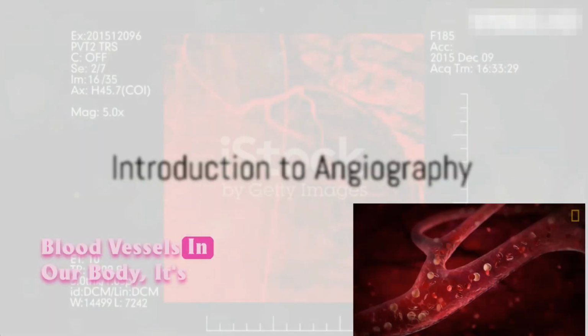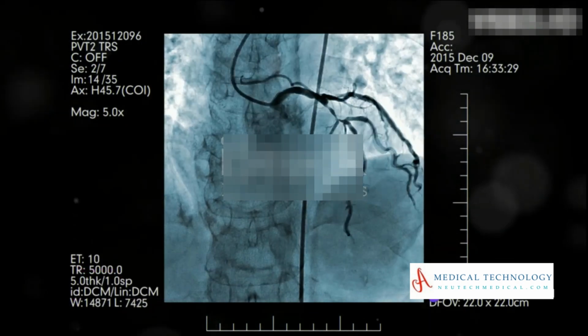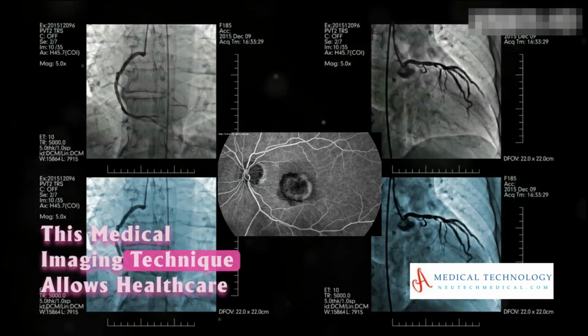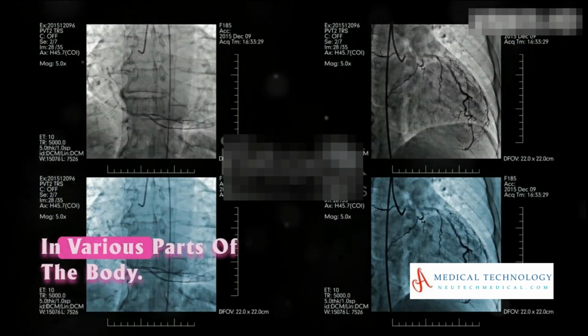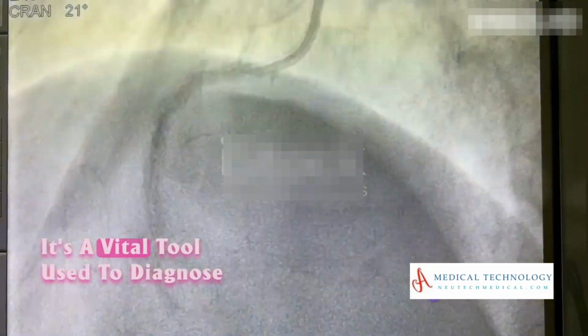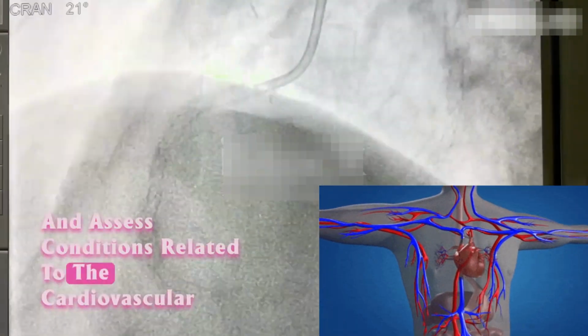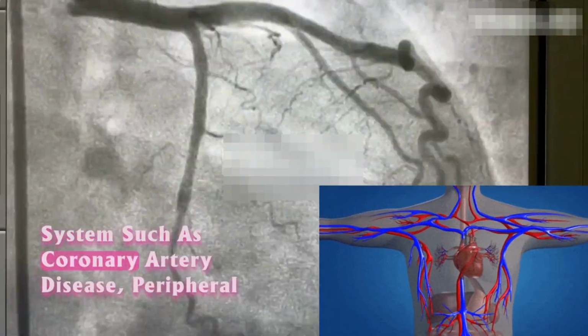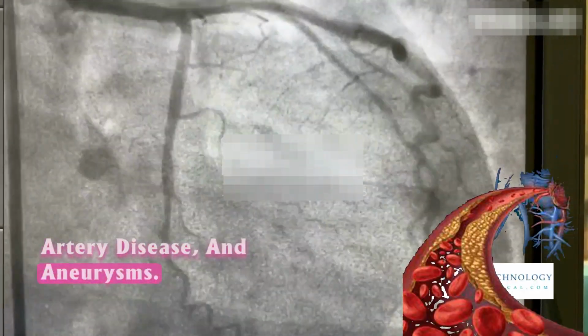Ever wondered how doctors visualize the blood vessels in our body? It's through a procedure called angiography. This medical imaging technique allows healthcare professionals to see the blood vessels in various parts of the body. It's a vital tool used to diagnose and assess conditions related to the cardiovascular system, such as coronary artery disease, peripheral artery disease, and aneurysms.